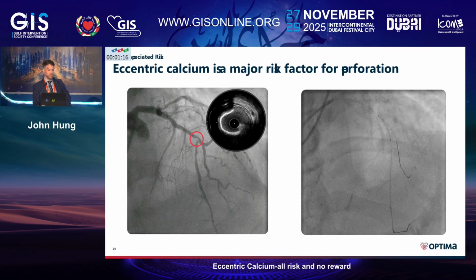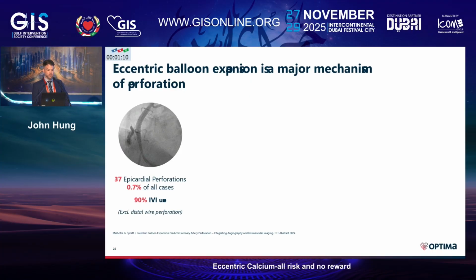This was the result. Now, I don't think the balloon was oversized, but this is what happens in eccentric calcium. And if you take some data that was recently acquired at St. George's by Professor Spratt and his team, they looked at 37 perforations, which wasn't that infrequent. It was just under 1% of all of the cases performed.